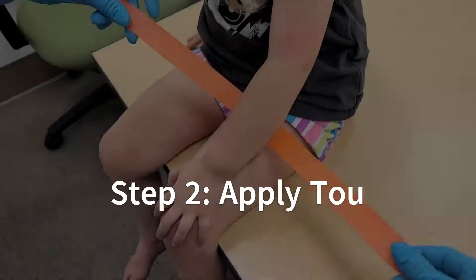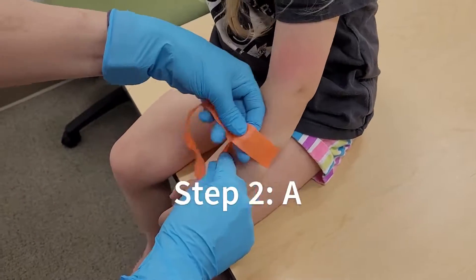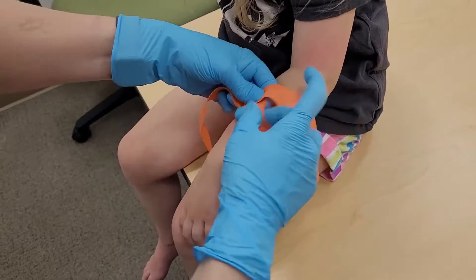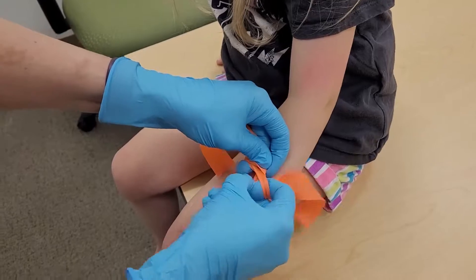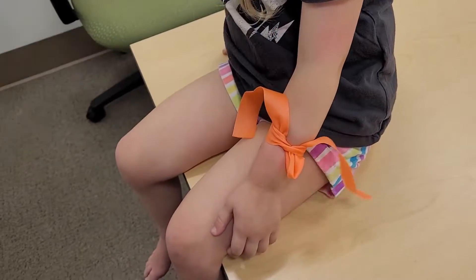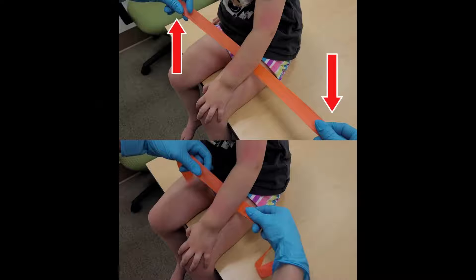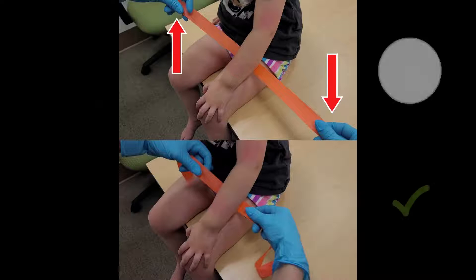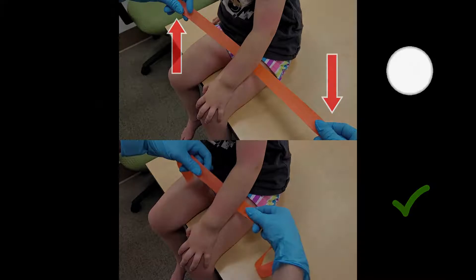Step 2. Once you have identified your site, apply a tourniquet proximal to the vein using a slipknot so that it can easily be removed later. A common mistake learners make is gripping the ends of the tourniquet, which results in a knot that is too loose and does not properly occlude the vein.